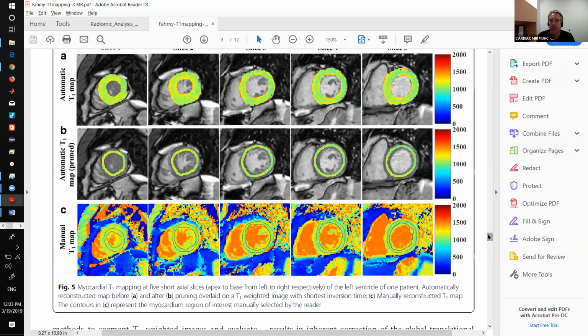Okay, yeah. Any other questions from the floor or any participating? Hi, maybe a really quick question. Thank you so much for the nice presentation. My question was about the polar map. So, what is the reference point or 0 degree for the polar map? Do you use the insertion points, or do you always have a certain assumption to start your polar map?